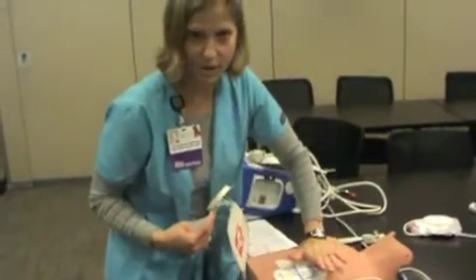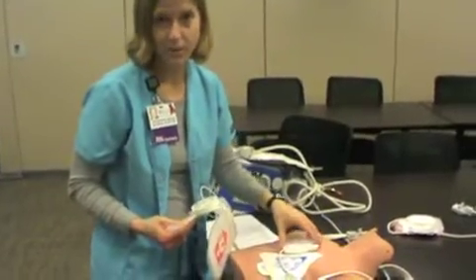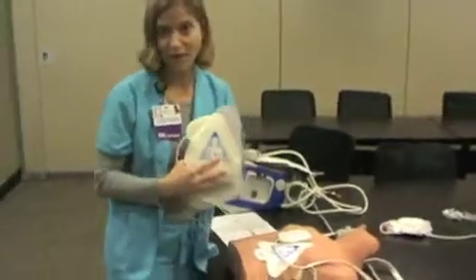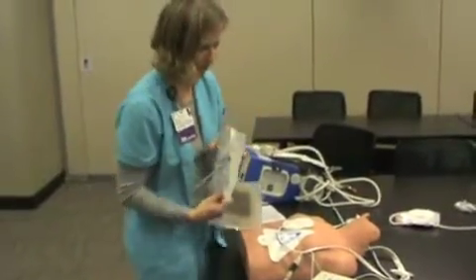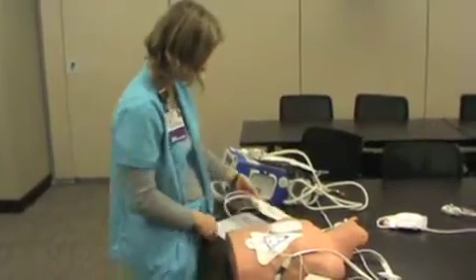You'll be doing your chest compressions right on top of that. So it needs to go right on the lower half of the sternum where you want to do good chest compressions. And then this patch is very important to go over the heart. So we'll place those according to the picture.